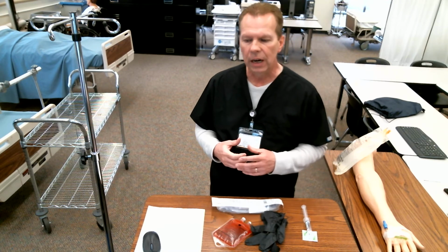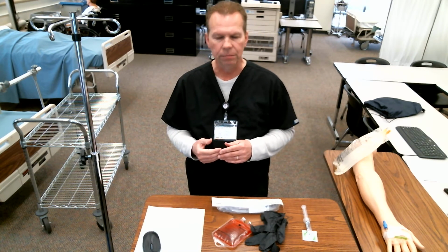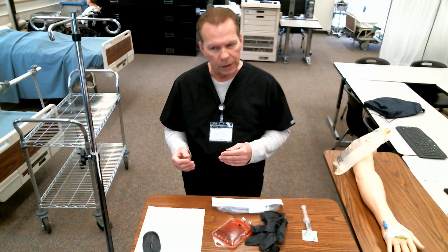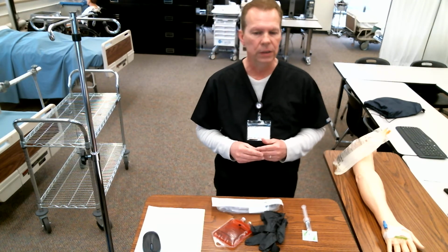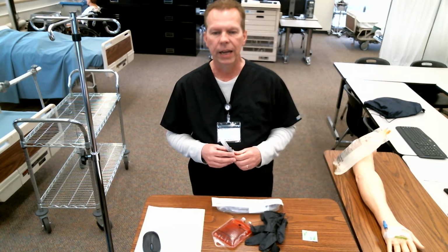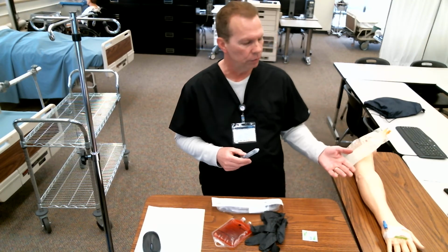I want to make sure that I have a large bore access needle in. So if they've just got a 22 gauge, that's not sufficient. We can do it through a 20, not preferable, but it can be done. 18 gauge is the most preferable. So I'm going to make sure that my patient has a bare minimum of 20 gauge, 18 gauge preferred.